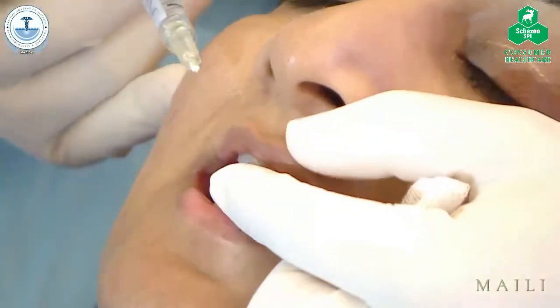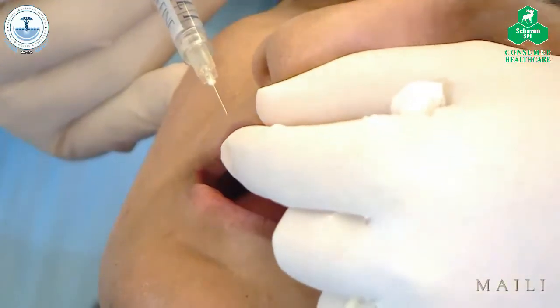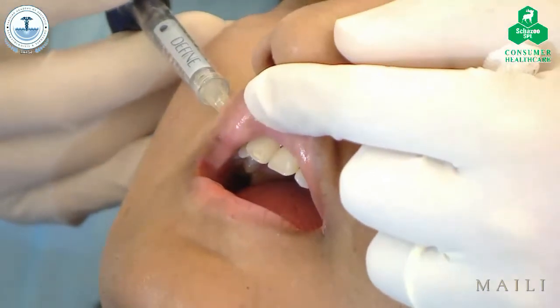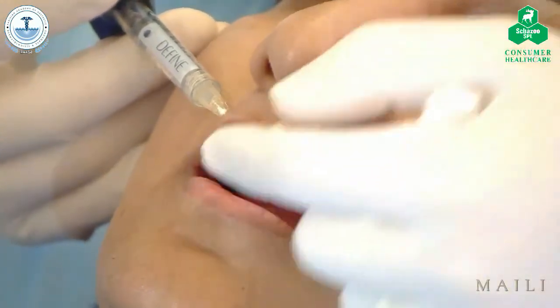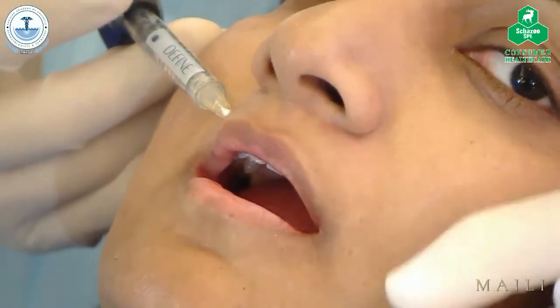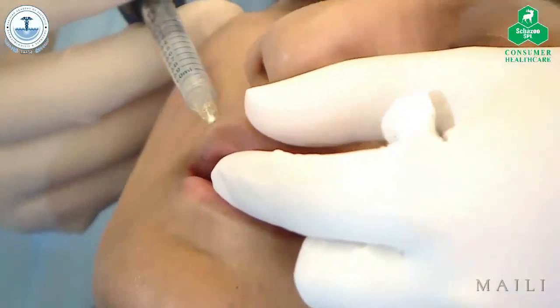Okay, can you open your mouth a little bit? So I'm going to go through the skin. 1, 2, 3. You see in the back, the tip of the needle? I am on the mucosa side of the orbicularis. And I'm going to place a small bolus right under the cupid's bow. So you can see the scale there.